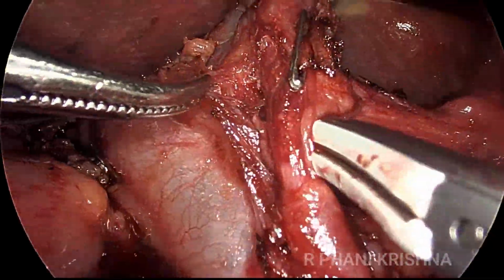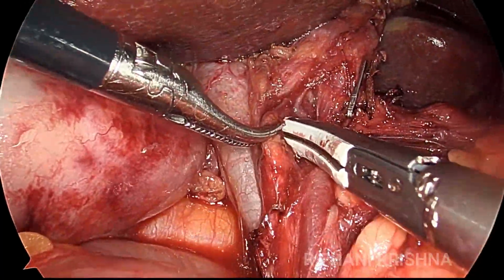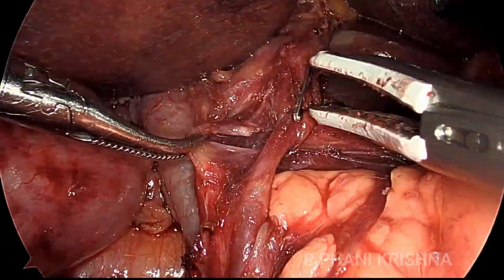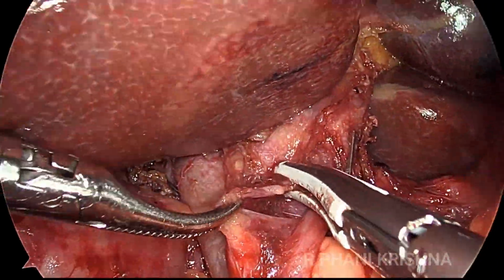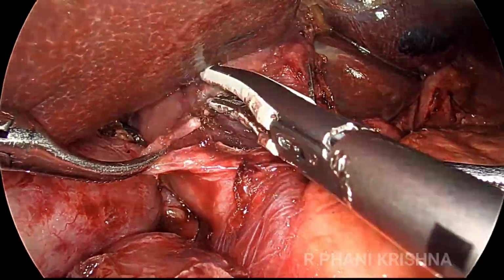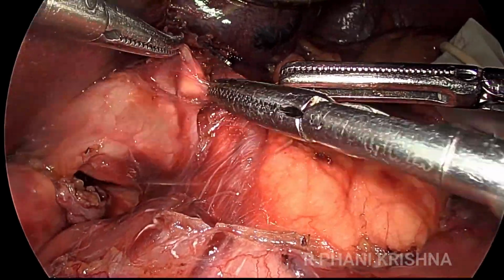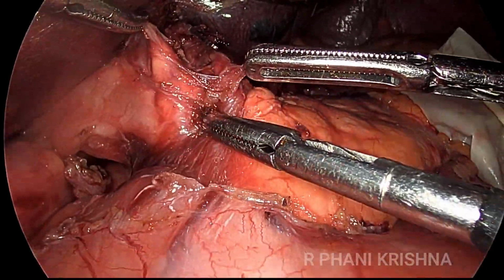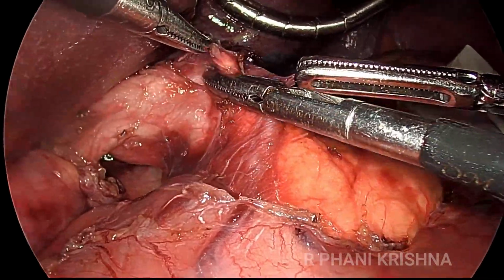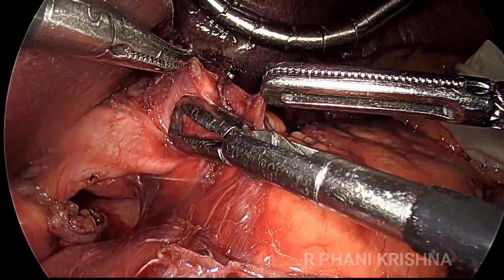Also identifying the portal vein there, lifting the tissues of the portal vein. And once the portal vein is defined, we can dissect the lymph node and the lymphatic tissue within the hepatoduodenal ligament between the common hepatic artery and the bile duct. Again, all this dissection has to be very meticulous. Make sure that you don't accidentally injure either the hepatic artery or the bile duct.